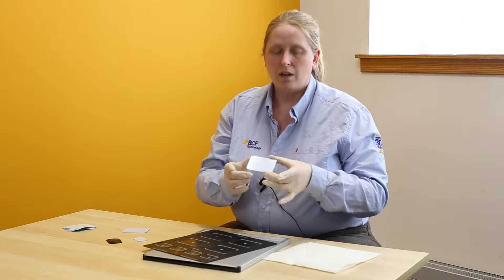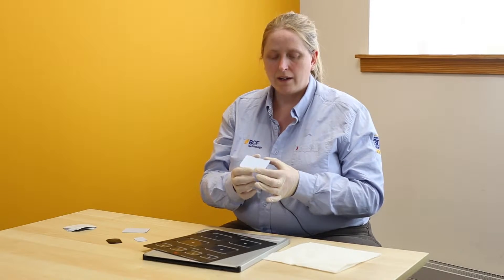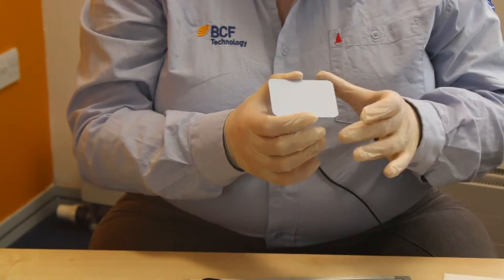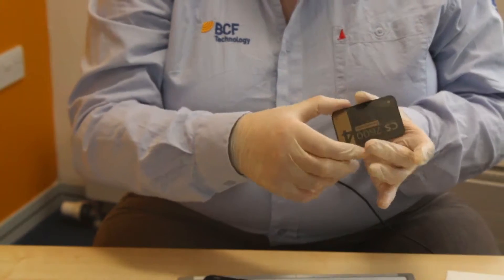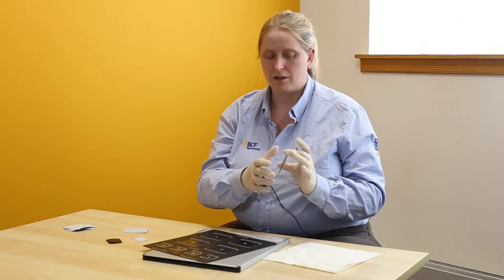I want to talk to you a little bit about the screens just so you know what they do. The white side is the active side and this is the side you actually take your x-ray on. In the little corner there is a marker, and the marker is replicated on the back side, which enables you to orientate the screen within the dog's mouth.